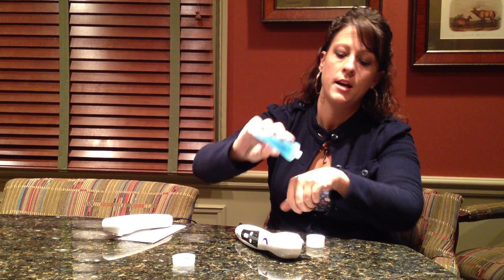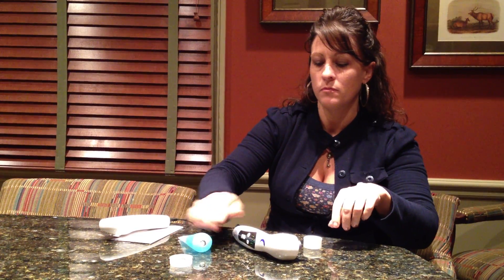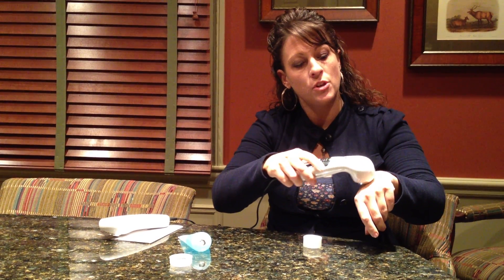Then you will apply a generous amount of ultrasound gel to the affected area and do circular motions on your skin.